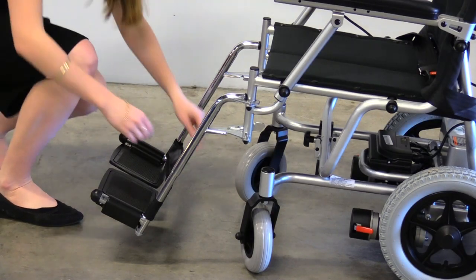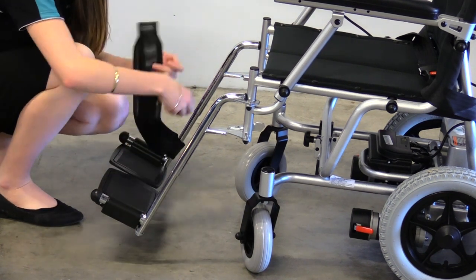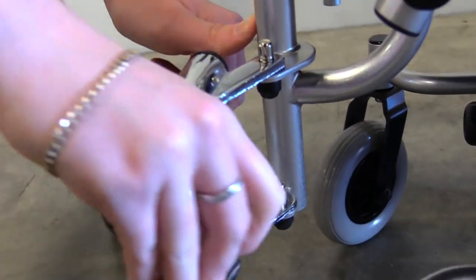To disassemble your Puzzle, first remove the leg rest. Press the lever and push the leg rest away from the seat. Pull the leg rest up and off the metal rods.